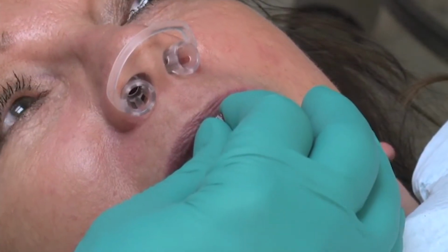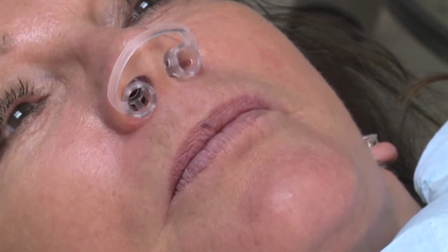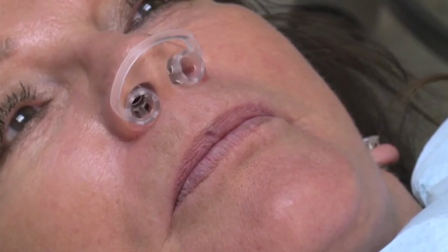Once more. Good. And open. Kim, how'd that feel on your jaw joint? Good. No pain? None. All right. Let's see what 2 millimeters of horizontal movement does for us.